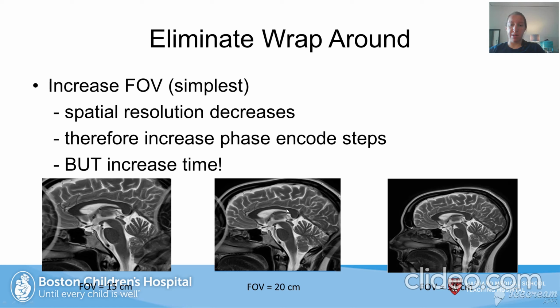This is a 20 centimeter field of view and 30 centimeter field of view. So, what you could do is, if you really wanted to see the front part of the image here, you may or may not be able to use it in these, and definitely would not be able to use it in this image. You might have some luck here. But if you want to see this entire front part here, acquire all the data, and then just chop away at whichever data you don't need.